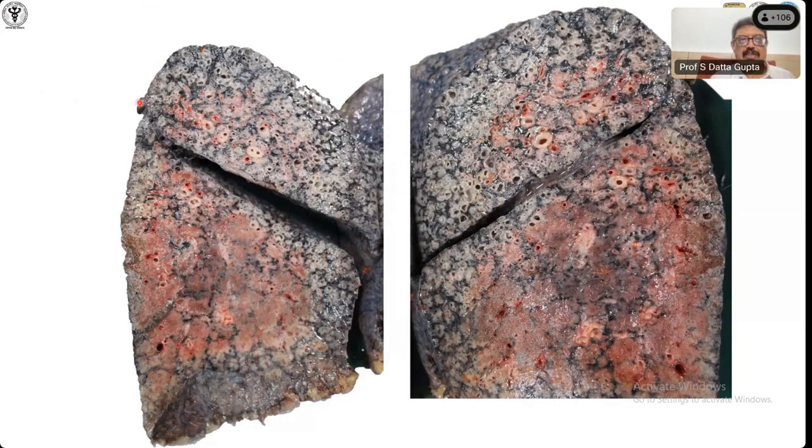This is the excised lung of that transplant. Excised lung, this central part is unfixed. Can you see this? There are some cystic dilated structures, nodularity. There is uninvolved lung parenchyma in between, multilobar involvement, peribronchial location. All those features, it is a case of hypersensitivity pneumonitis. He was a case of hypersensitivity pneumonitis. Can we call it temporal heterogeneity in this?